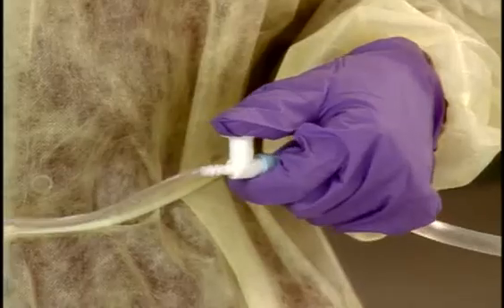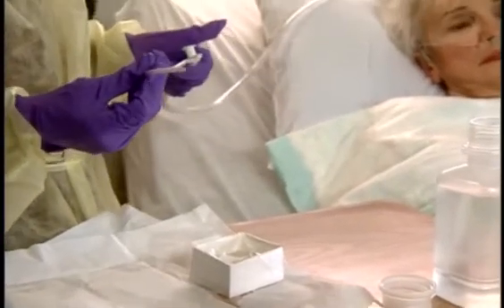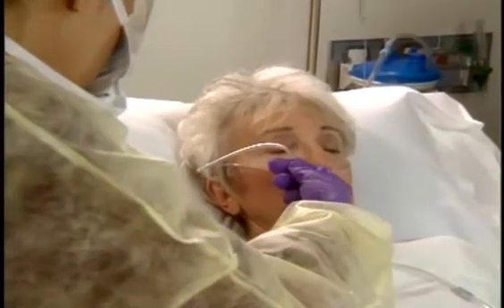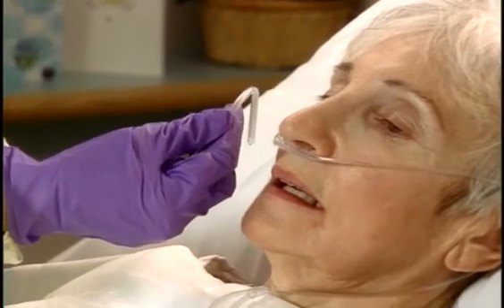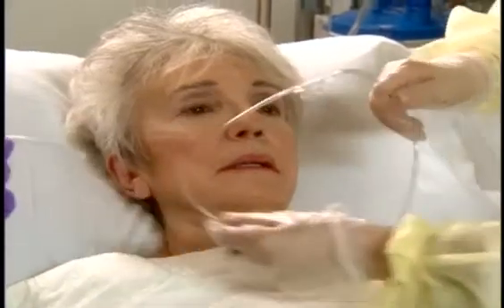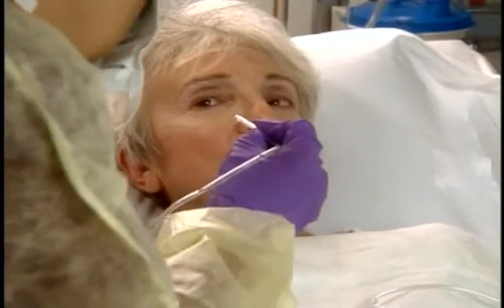Okay, looks good. Now estimate the distance from the patient's earlobe to her nostril. And then place your thumb and forefinger of your sterile hand at the point on the catheter that equals the estimated distance. So that's the distance that the catheter will be inserted. Got it. Now I'll insert the catheter without applying any suction.